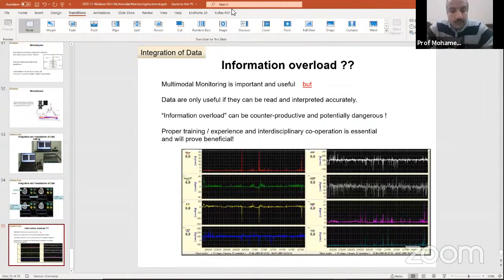Sure, yeah. I would like to thank Dr. Jorn for this refreshing information about neuromonitoring, and thanks Dr. Hassan for leading this session. Basically, I'd like to have a comment, and then I have a question. My comment is, when we do surgery or monitoring to give a decision for surgery, we are going to make volume changes and pressure changes. So as Dr. Hassan said, I will be interested more in the ICP levels rather than the saturation levels as an indicator for the prognostic value for my intervention. Because if I'm going to open the skull, my first aim is to release the pressure. So I must have a clue that there is increased intracranial pressure.